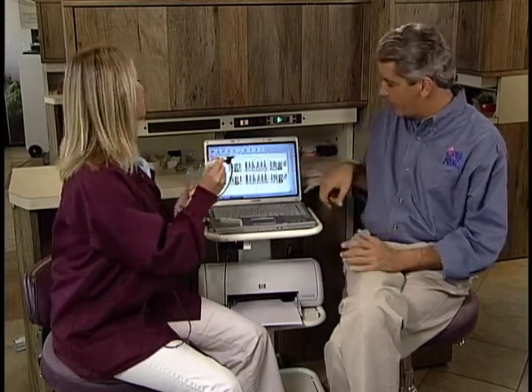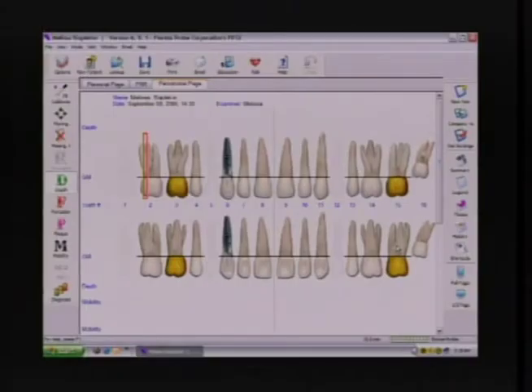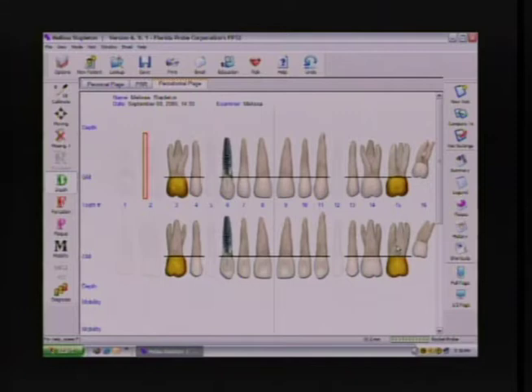So quick. Cursor's on the instrument, 2. Use the butt end of the instrument. Hit the delete key, which is the keyboard shortcut. Missing. Perfect. Now you just held it too long. Hit it one more time. Missing. Because it put it back in. Okay. Now advance your cursor with the foot pedal. You're on the distal buckle of 3, and we start probing.